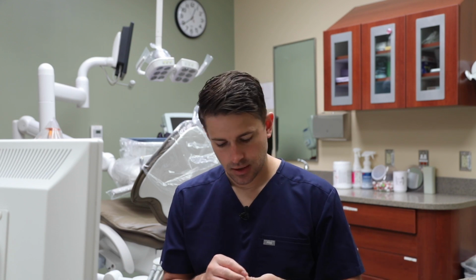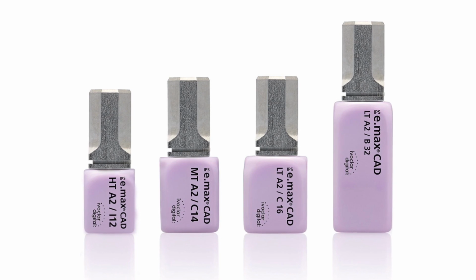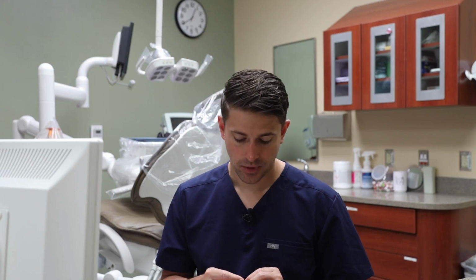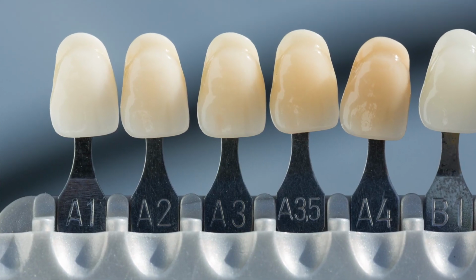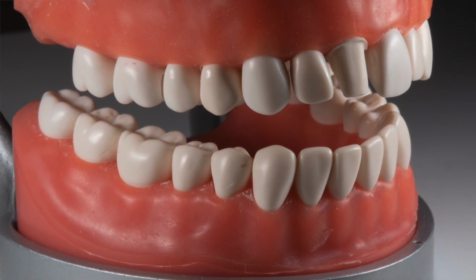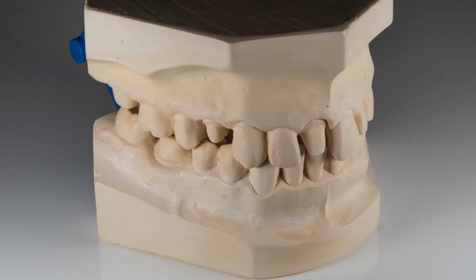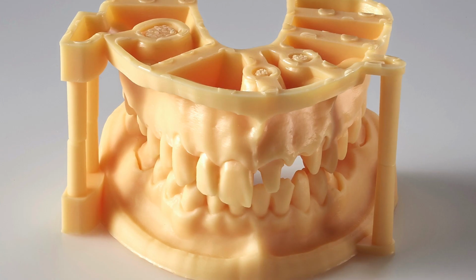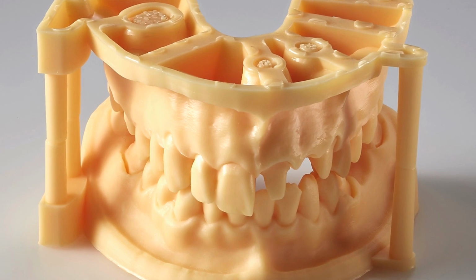So with a custom shade guide, you have a crown that is made out of the material that you commonly use. I use e.max a lot for indirect restorations, whether it be in the posterior or the anterior. Most of our shade guides, if you look at the Vita shade guides, are of anterior teeth. So what I did is I took a dentiform and I prepped number 8. You could use a model. If you already have a model that's prepped, you could do just about anything you want. You could 3D print a model if you wanted, if you have that capability.